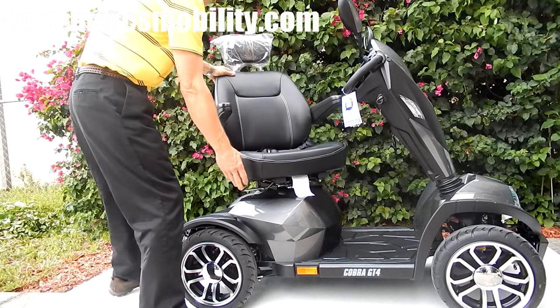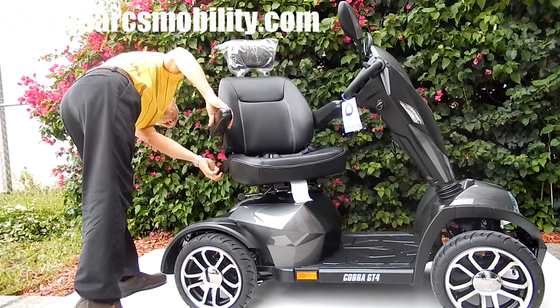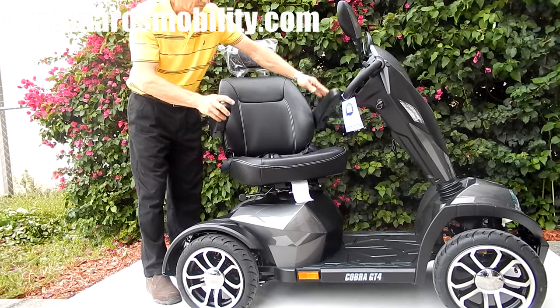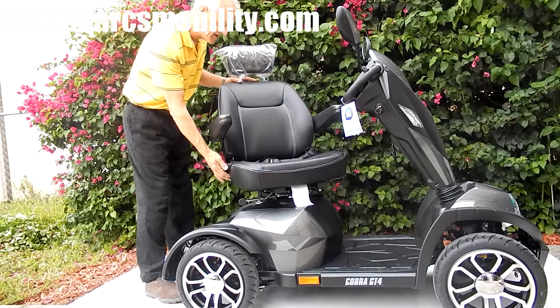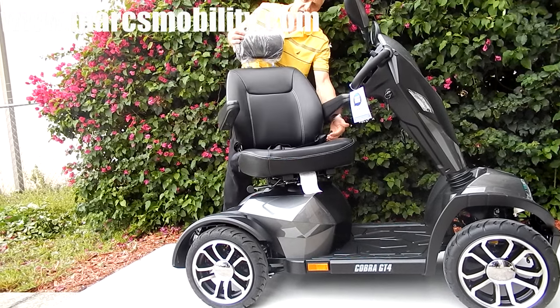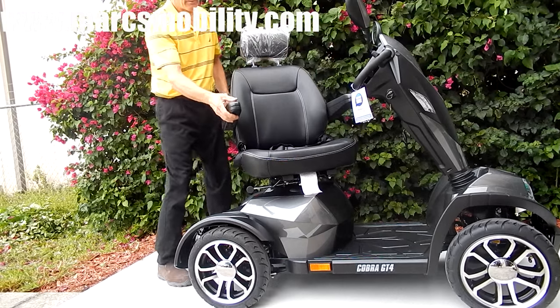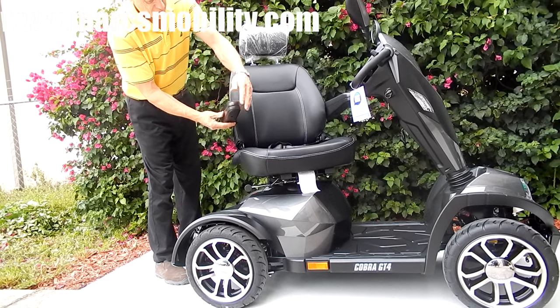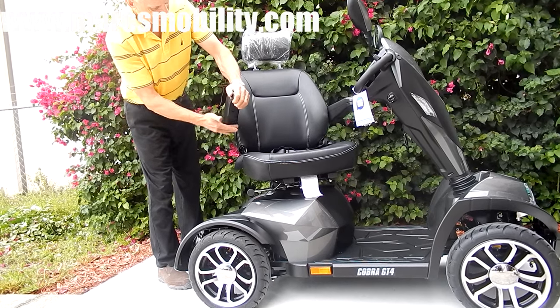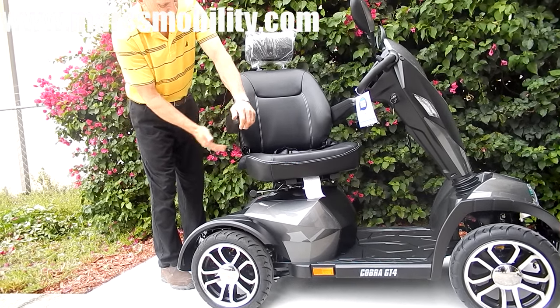This is your swivel. The arms on this scooter are adjustable up and down. The seat is adjustable right here — you can adjust your seat. The arms can be adjusted right back here by this little lever, which gives you more tilt or less tilt on your arms.